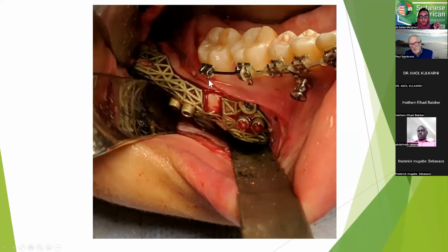This is what I was talking about with the mandible. The amount of soft tissue stripping from the mandible, I feel, is far too much. And this is not essential for a sagittal split osteotomy. There is no reason to place a cutting guide for a sagittal split. I think most, if not all, oral maxillofacial surgeons can perform a sagittal split of the mandible freehand without the need for a cutting guide. Where a cutting guide is helpful is where you're having to set back a mandible and you need to remove a piece of bone.